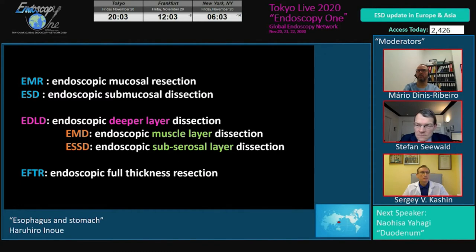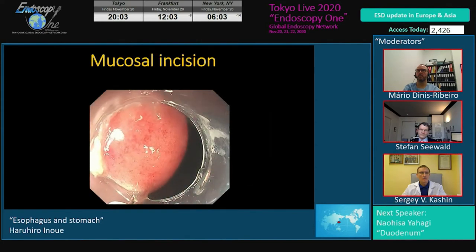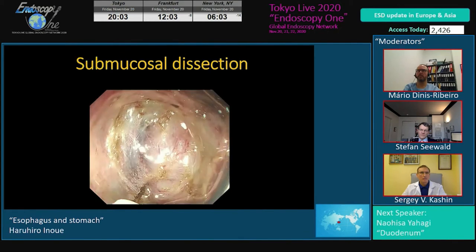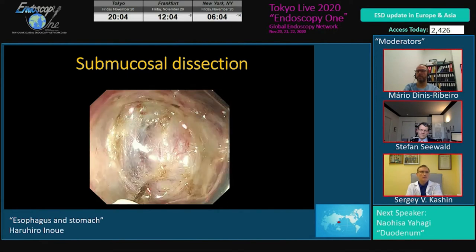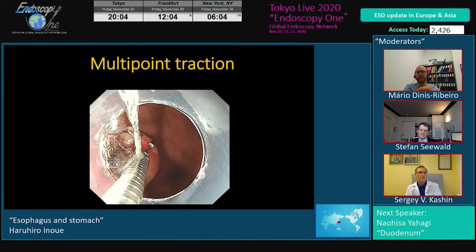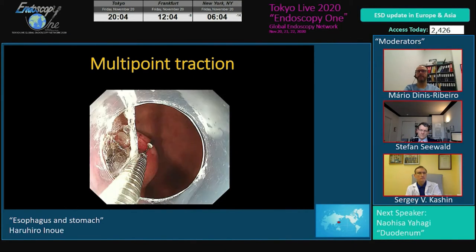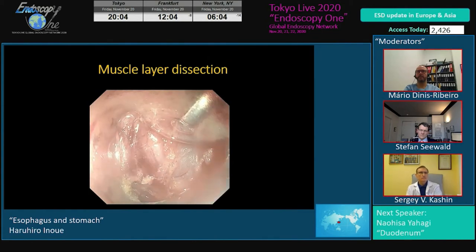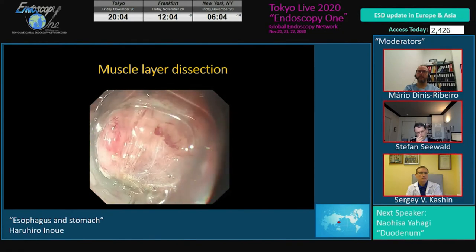So last, I would like to mention a little bit about full thickness resection. This is again a submucosal tumor in the gastric fornix. We place the mucosal incision first, then we place a counter traction using the multi-point traction technique. This is the first clip. Then we pull the tissue up and approach beneath the tumor.